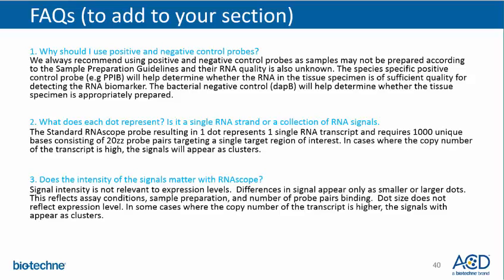Another question, a technical question related to the RNAscope assay that has come up is what is the recommended thickness of FFPE samples? Well, the answer to that is that the thickness of the sections that is used for the assay lies between 4 and 6 micrometers.